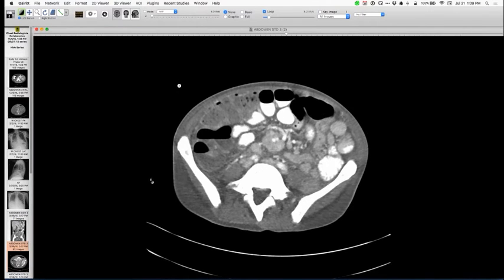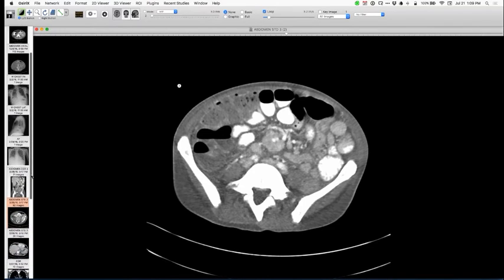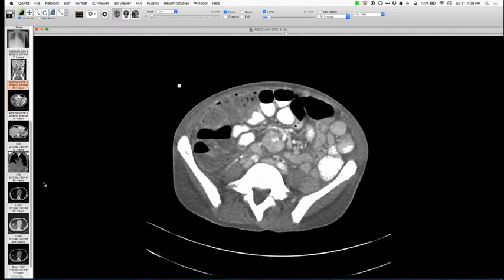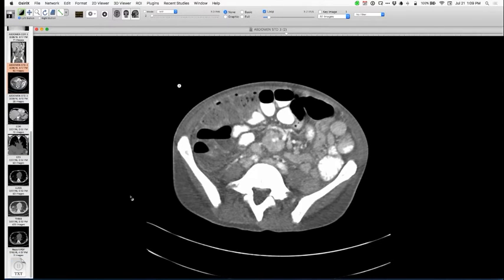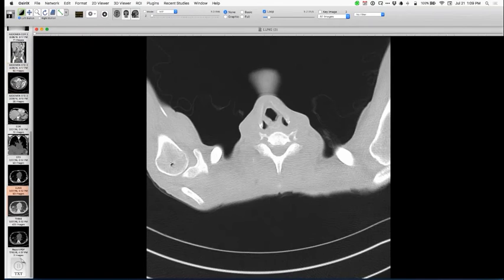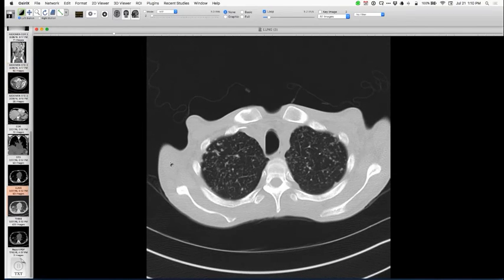What was found in his biopsy or the peritoneal fluid was mycobacterium. And he is an HIV positive patient, so he's got evidence of that infection. To continue along, he's really sick. He's getting percutaneous drains and so on. And at some point in time, he gets his chest imaged, and his chest looks like this.